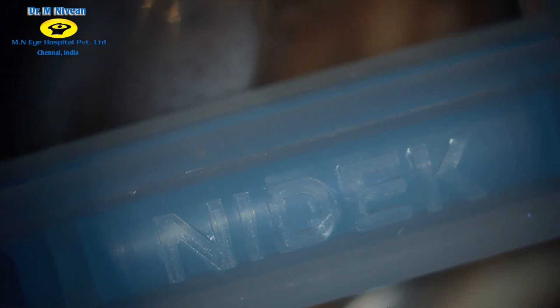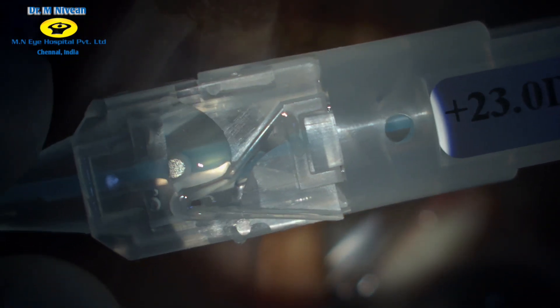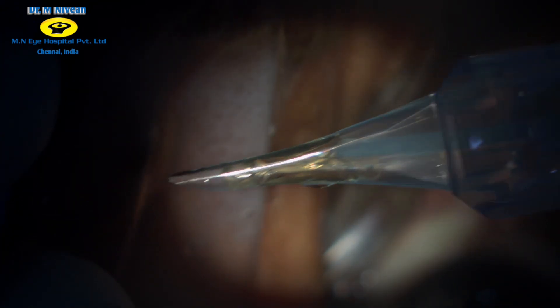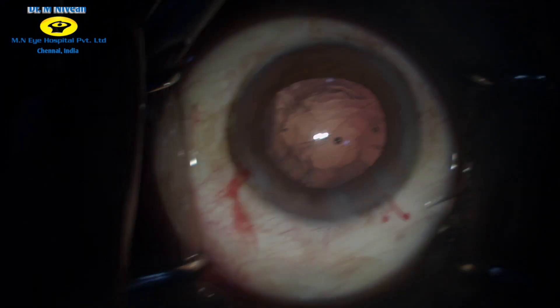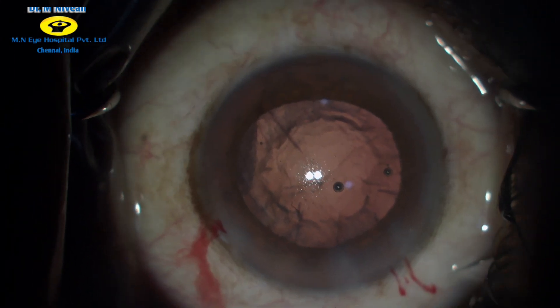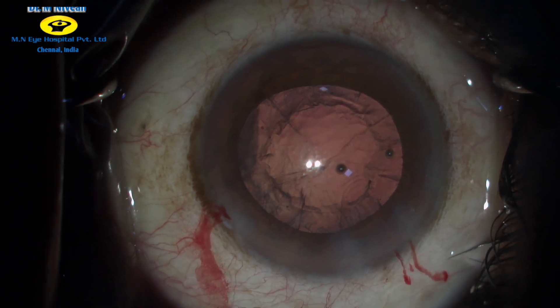This is a pre-loaded Nidek Acryos SP foldable intraocular lens which can be injected even through a 2.2 mm corneal incision. It is known for its 360-degree square edge, which reduces the incidence of PCO, and also for its blast finishing, which reduces adherence and improves visibility of the haptic during implantation.